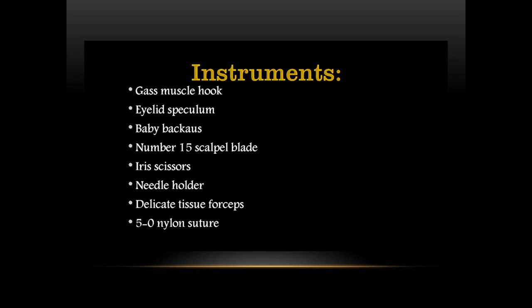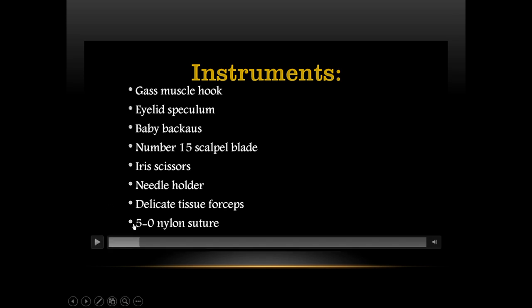In this technique, we do not use absorbable suture. You gotta use non-absorbable suture. So the suture of choice is a 5-0 nylon suture, okay?